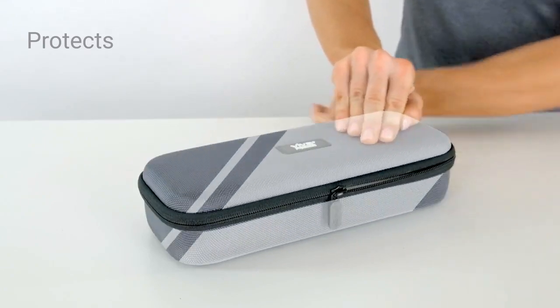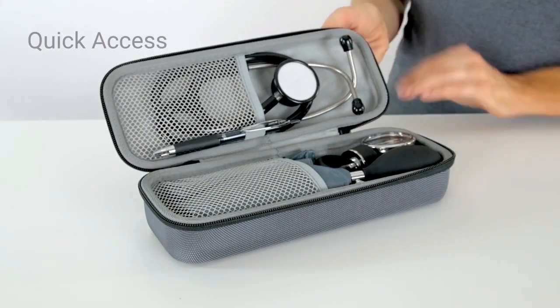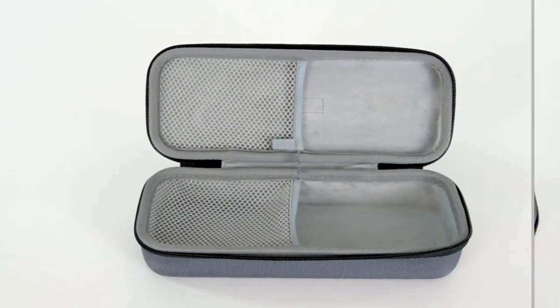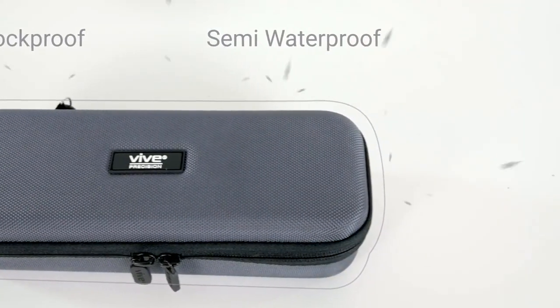Hard EVA material protects contents from damage while dual rubber grip zippers provide quick access. Extra soft interior lining and double mesh pockets hold equipment safely and snugly. Shockproof and exceptionally durable, the case is also semi-waterproof.